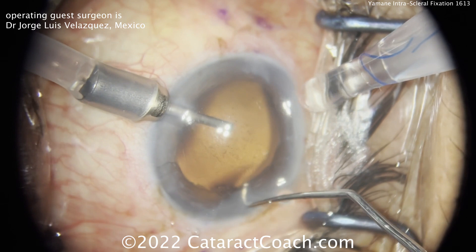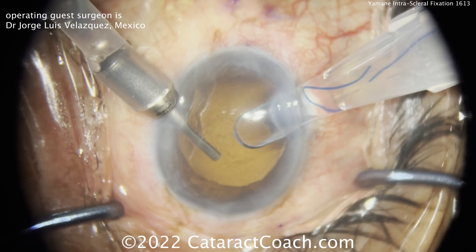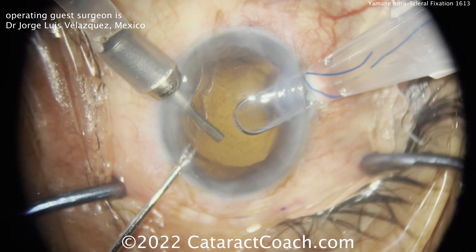My critique of doing Yamane is that oftentimes the IOL is floating around in the middle of the vitreous, the haptics are all over the place, you're catching vitreous, tangling it up, and getting vitreous traction. But not here — here's what happens in this case.